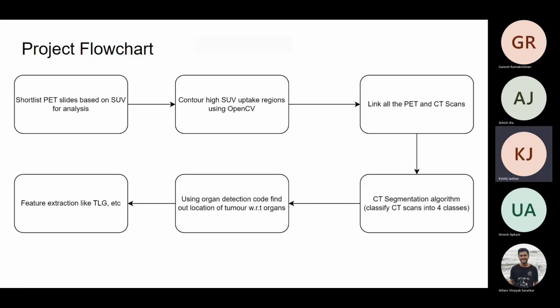So he can just pass the original CT scan, the one corresponding to the PET scan image, as test data to identify which organ it is. Correct? Suppose it is in the kidney. Yes. It identifies the kidney.